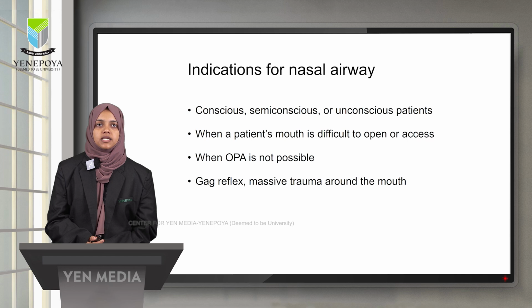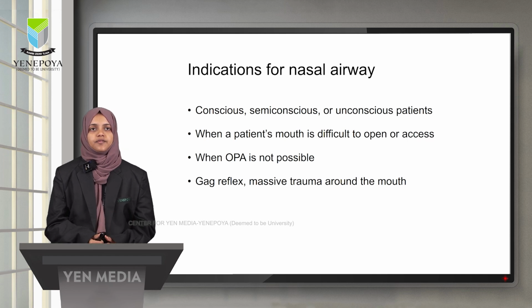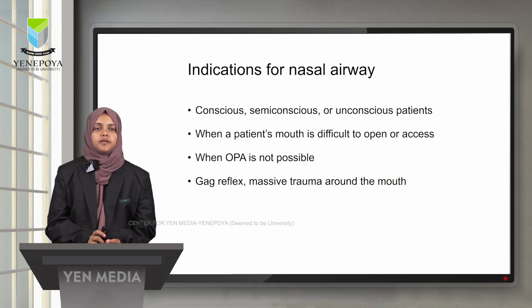Now coming to indications. When do we use a nasal airway? A nasal airway should be used if the patient is conscious, semi-conscious, or it can be used for unconscious patients also. When a patient's mouth is difficult to open or access, or when an oropharyngeal airway cannot be inserted, or when their gag reflex is intact, or massive trauma around the mouth is there, a nasopharyngeal airway should be used.